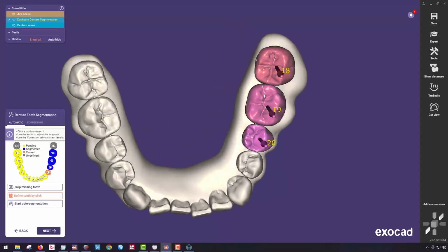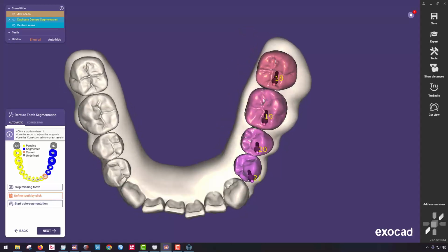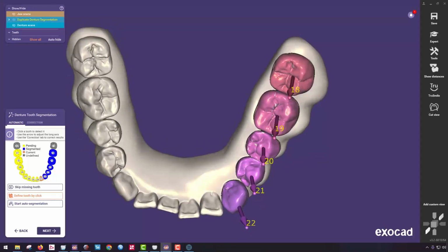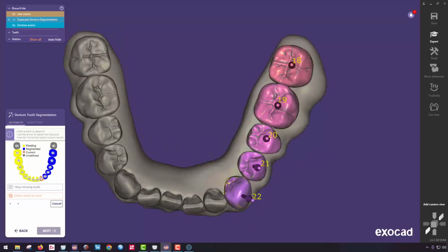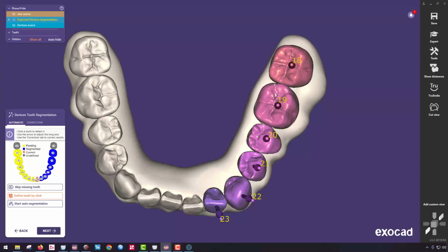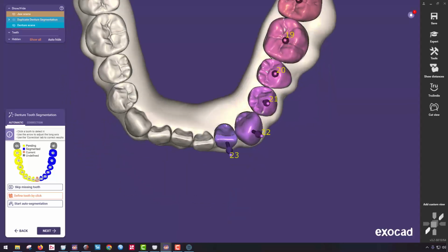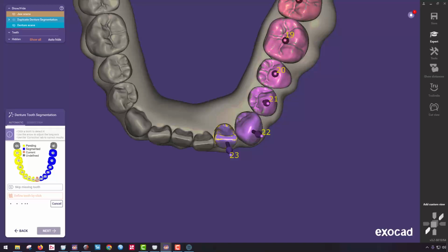There we go. Usually when you use the anatomic pontics functionality, it knows exactly where the margins of these teeth are. So choose the incisal edge, just by left clicking. I'm just following the prompts in the software. It's asking for tooth number 24. Here's tooth number 24.